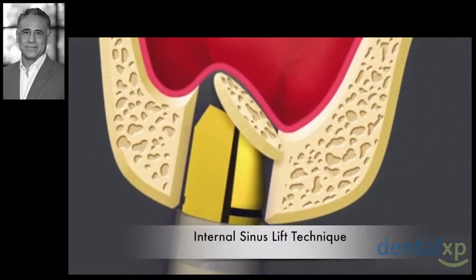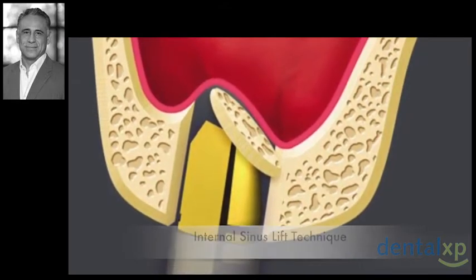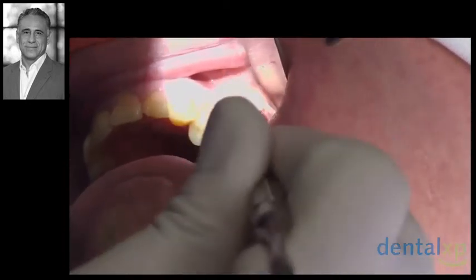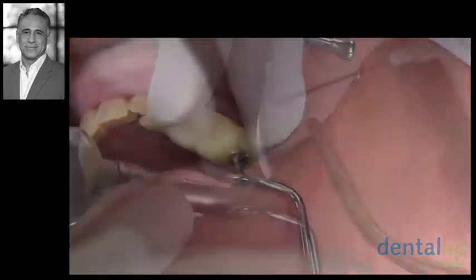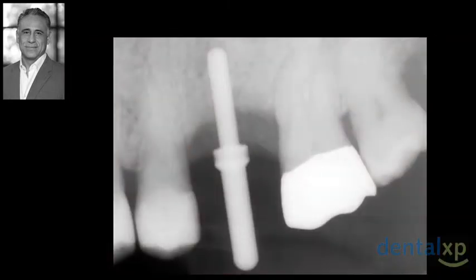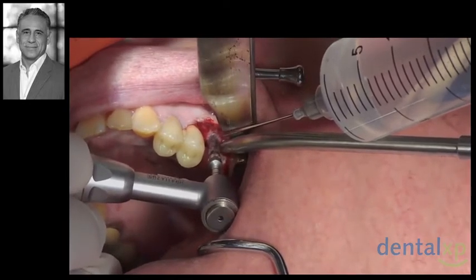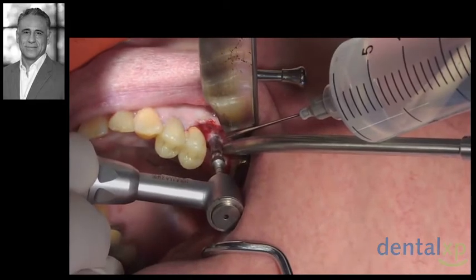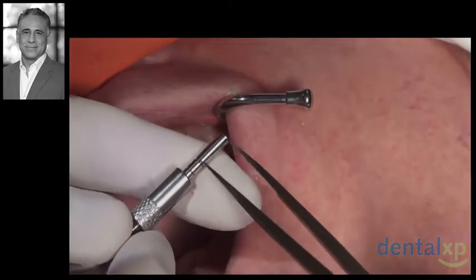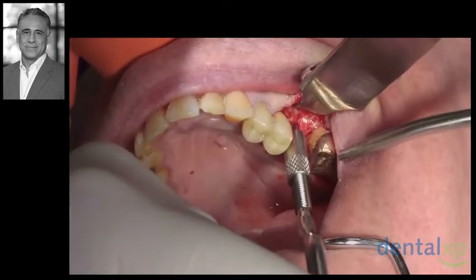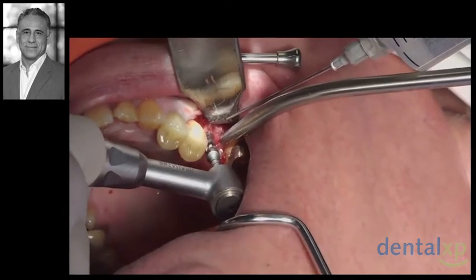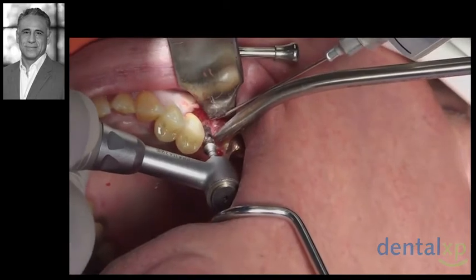We'll also demonstrate the internal sinus lift technique using a series of sinus osteotomes. Here, we'll first create a mid-crestal incision and raise a very conservative submucoperiosteal flap. The initial osteotomy is done using our surgical guide and then verified with a guide pin and a periapical x-ray. We'll then continue the initial osteotomy using the osteodensification burr at about 5 to 6 millimeters depth, which is approximately three-quarters of our available height of bone. Next, we'll use an internal sinus lift osteotome and displace the apical bone more superiorly to about the 10 millimeter mark. Then we'll place the osteodensification burr again in reverse mode to densify the bone and expand it laterally and apically.